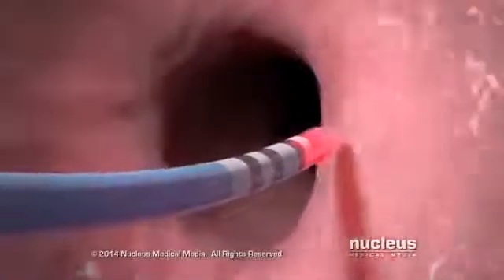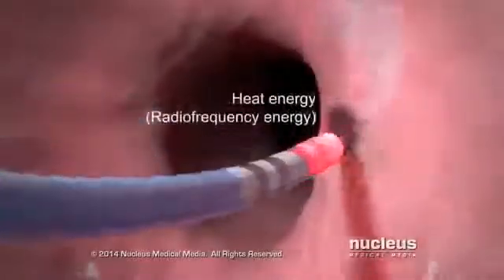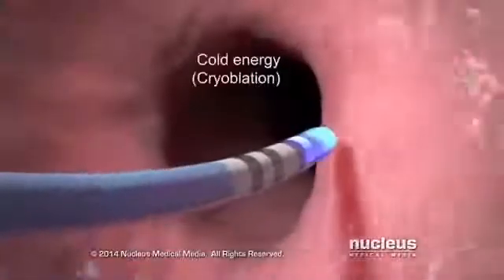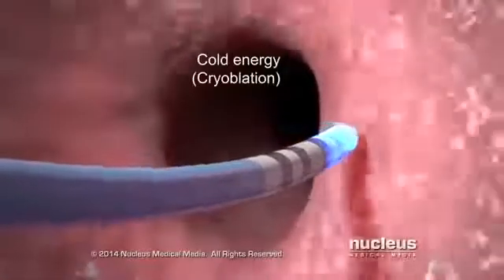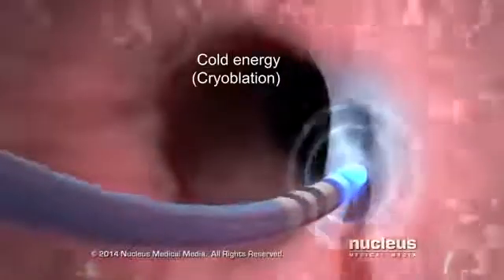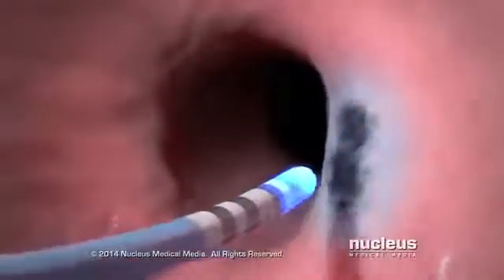The tip of the catheter will emit either hot energy or cold energy to ablate the tissue in this area. Ablation makes the treated area stop working.